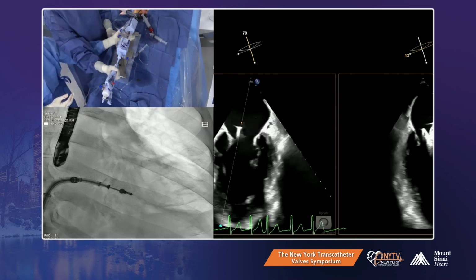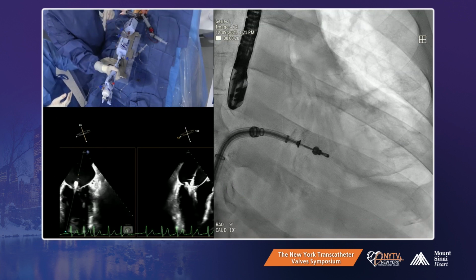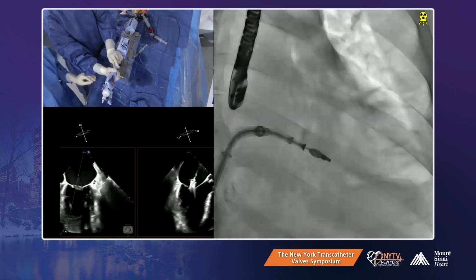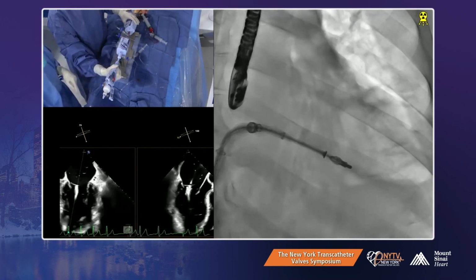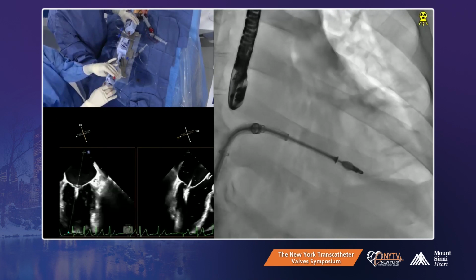Okay, what do you think about trajectory? Yeah, I think it looks nice. Pretty good, huh? Okay, we'll close the clip and then we'll go in. So, we'll go into the LV now. All right, we didn't spin, which is excellent. That's good. We're under the valve. Good. So I'm going to open the clip now.